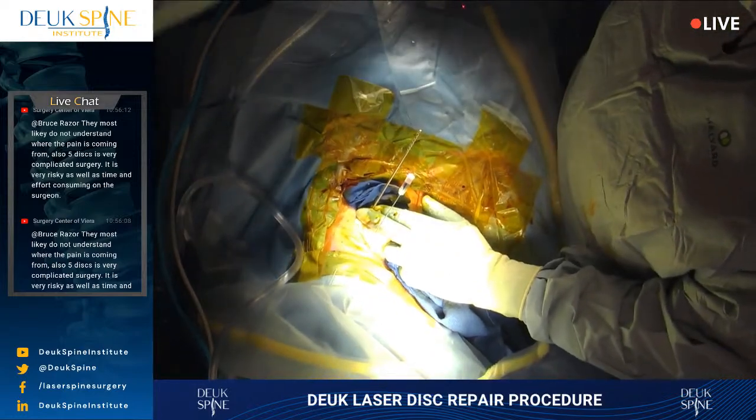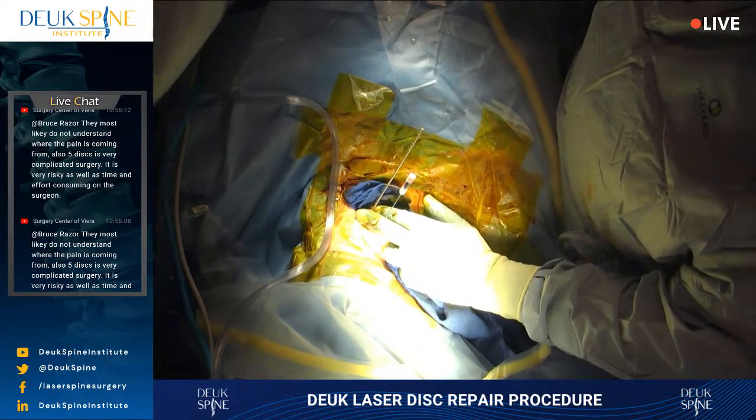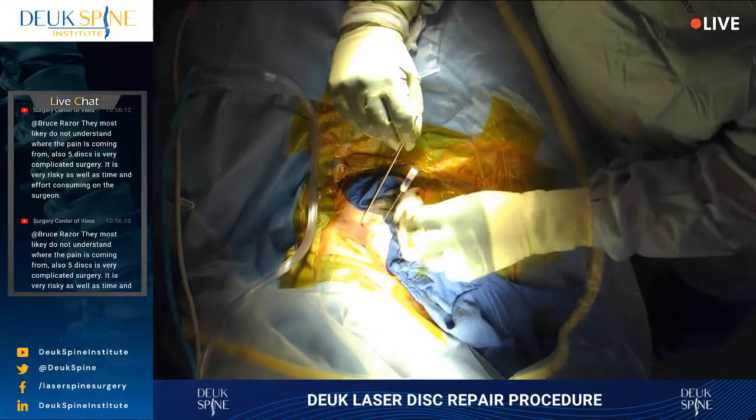Here, come on. I need you guys here with me right now. I need this not pointing at my elbow, okay? So whatever you do, get this out of the way. All right, we need the fluoro back in.